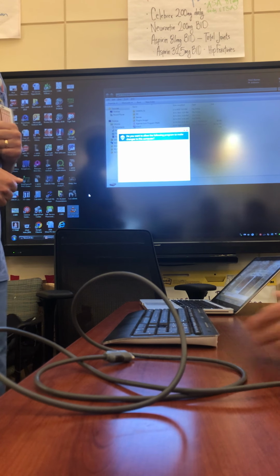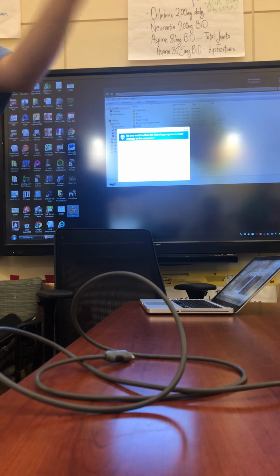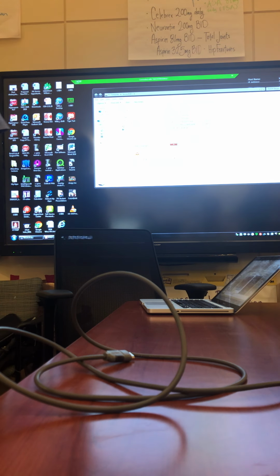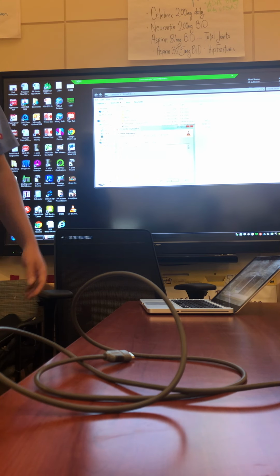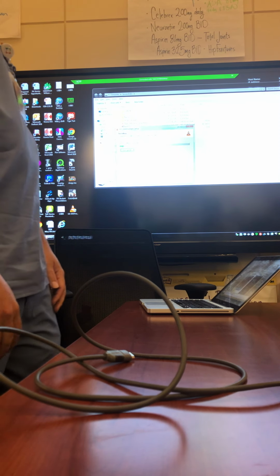Anyway, it's something that we're working on. I'm working with Dr. Coletti and the ED administration to get this up and running. Right now we're working on a process where you can put an order in Epic and then pull the order up on the ultrasound machine, which will pre-populate the patient's information. You can do the FAST, send it to PACS, and it'll be uploaded to the patient's chart. Then you can document positive or negative, and it can be reviewed by me at the trauma reviews every month.